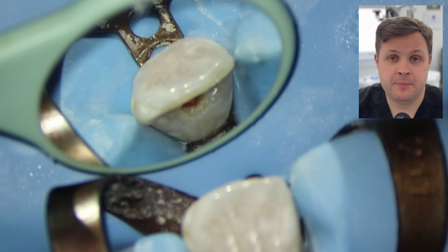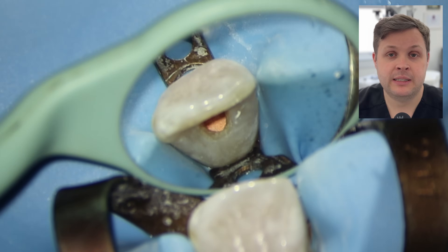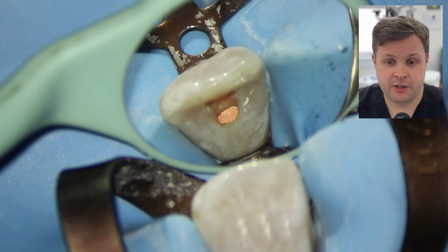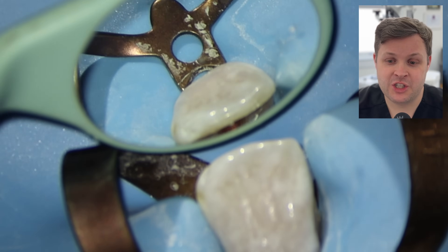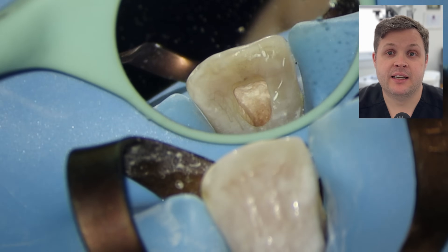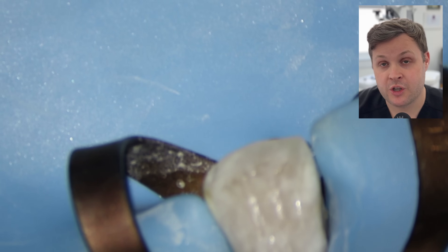What I'm going to do is cap over the GP cone with GIC — I use Vitrebond — and I'm going to fill the access cavity with whitening gel, a bit of PTFE and GI. I'm going to review the patient in a week or so's time. And overall, that's the case.